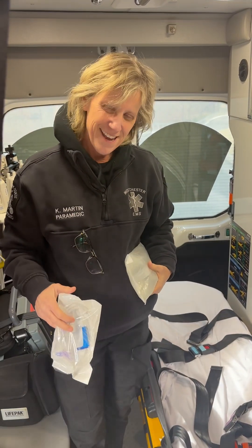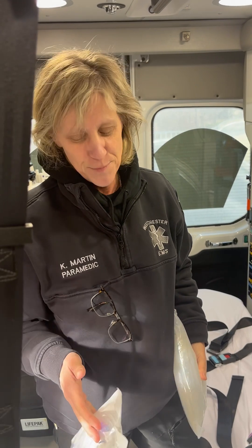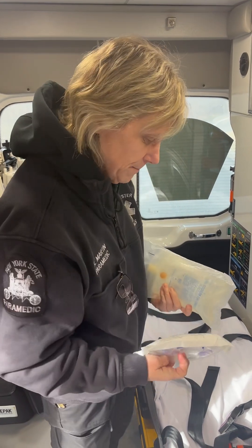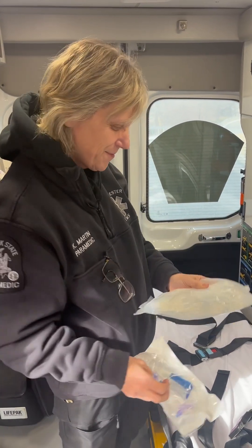Hey, what's up YouTube? This is Carrie with Z-Bone Graphics. I'm an artist, but I'm also a medic. So I'm going to show you guys how to spike a bag.